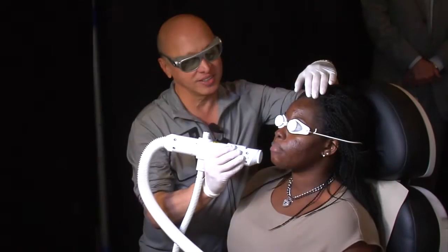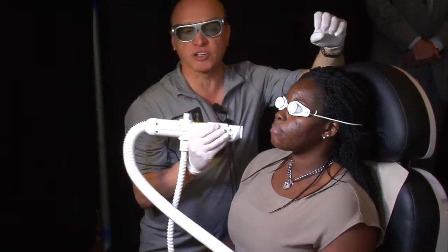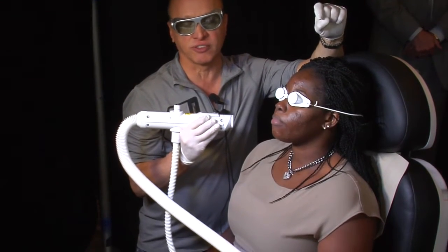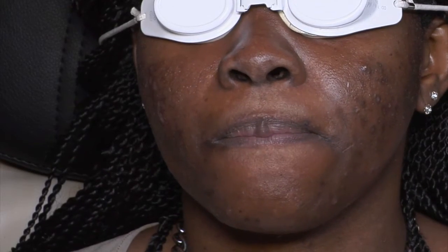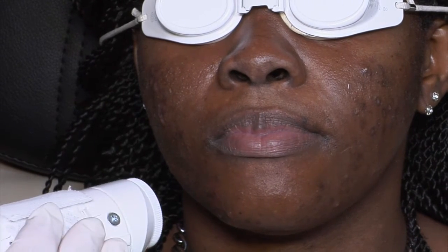The question was about endpoints. What's the endpoint that you're looking at — is it just passes? The endpoint in darker skin, there isn't one, because you can't really see the change. In lighter skin, I try to get a little bit of a flush. But in her situation, I'm just going to go over everything twice and then go after individual lesions a couple of times. That's my endpoint.